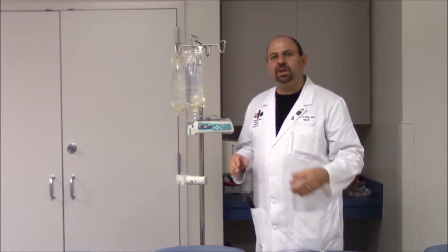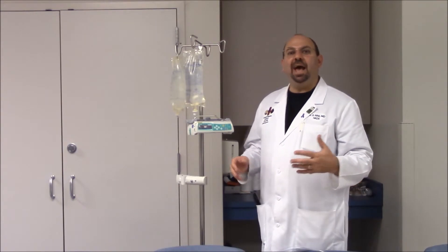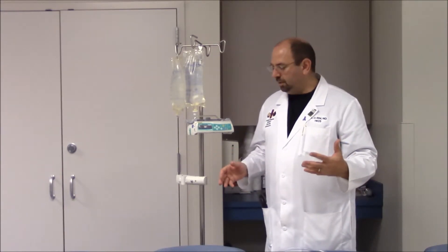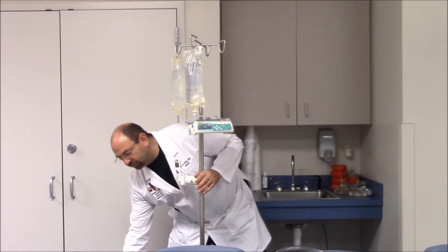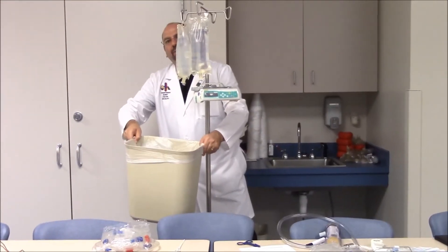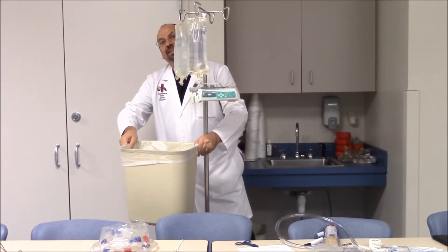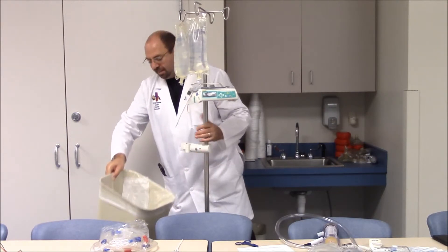Last but not least, to keep this procedure clean and not messy, we need a bucket where we can collect the fluid used for priming. We don't want water everywhere, as almost two liters of saline will be used.